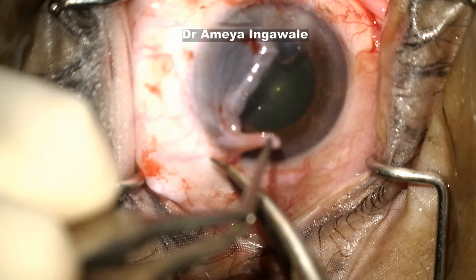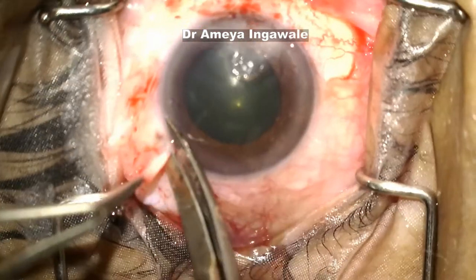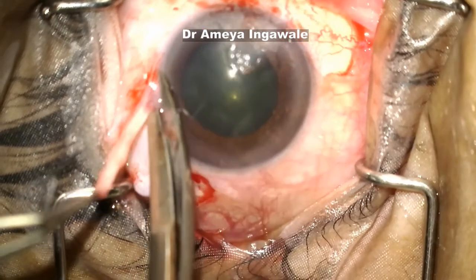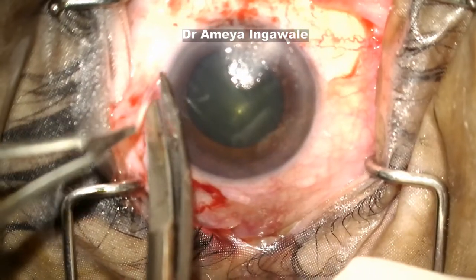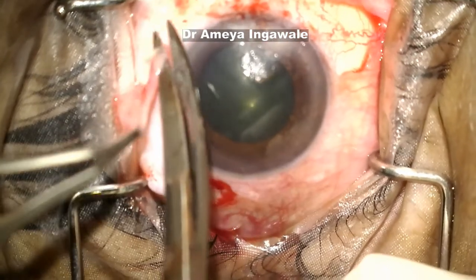Once you have separated the graft, you can cut it off. There is no need to take limbal stem cells in pterygium surgery — you just need the conjunctiva. There is no need to go into a deeper dissection into the cornea and take a keratolimbal autograft; that's not required. A conjunctival autograft is adequate.